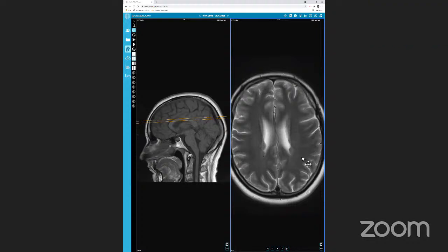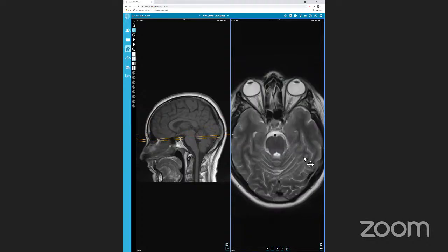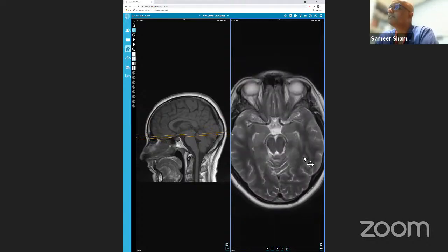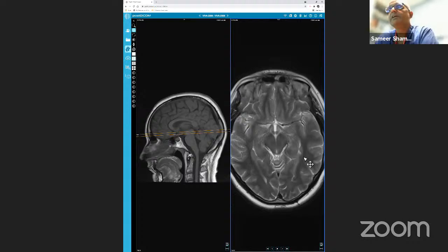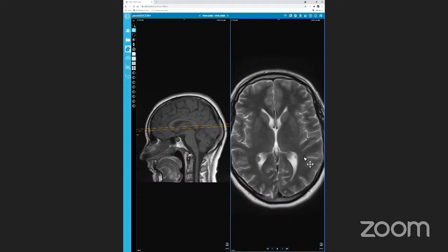Which is the other cause of seizures? Correct. Yeah. So this is a case of gray matter heterotopia. And what would you do in terms of management for this patient? So I'd alert the referring team. This patient needs to be discussed with the person who wrote it.